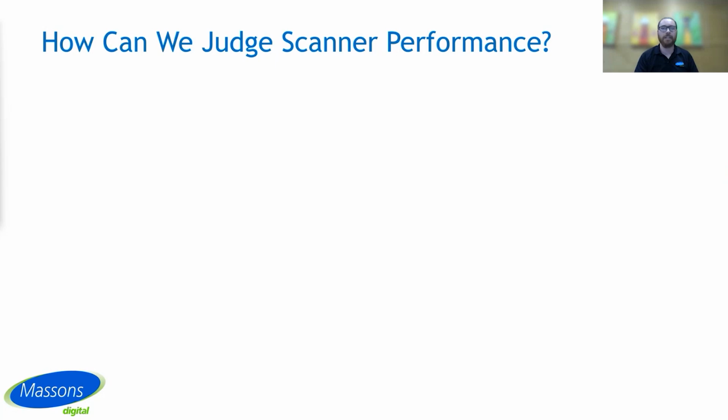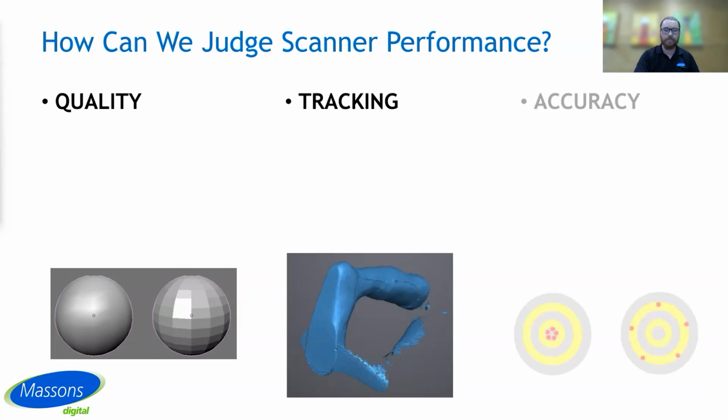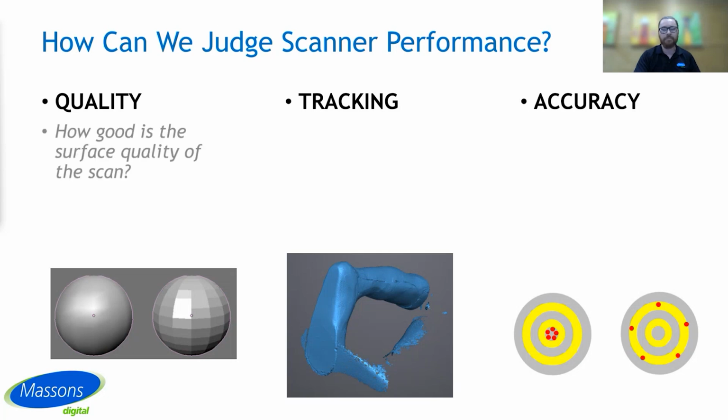So how do we judge a scanner's performance? I've really broken it down into 3 metrics that I think are useful. We're looking at the quality of the scan, the tracking capability of the scanner, and how accurate it is. So to break these 3 categories down a little further, for quality, how good is the surface quality of the scan?